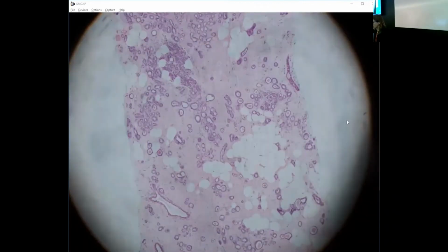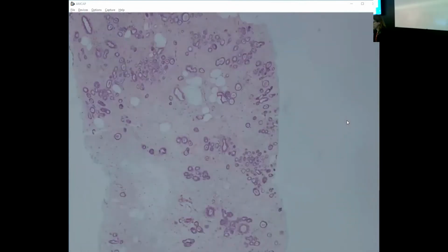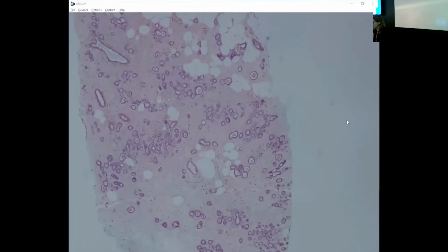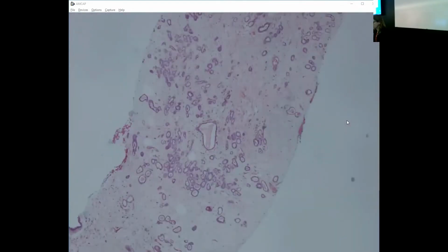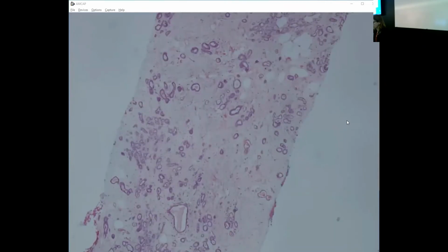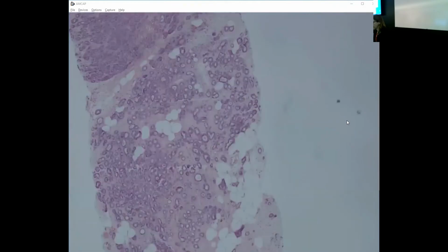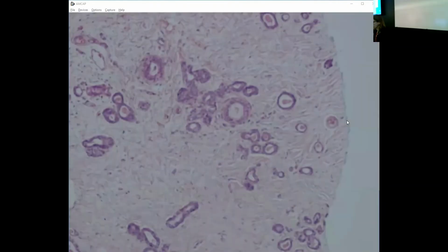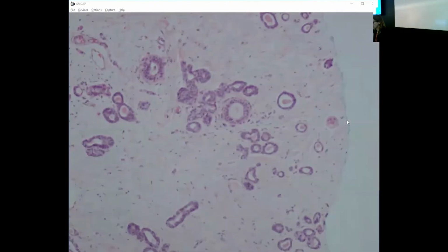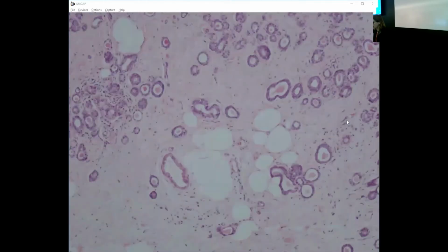So this would be one of those cases where, if it's not staining as you would expect, say you had called this a low-grade invasive ductal carcinoma, as you might for this case, where you have small glands infiltrating the stroma in a haphazard pattern. You could easily call this invasive ductal carcinoma. But if it came back as ER negative, then you should question the diagnosis, right? That doesn't make sense. And so they're strongly S100 positive, which is a positive sign that you can use to help with the diagnosis. This one has some atypical MGA.